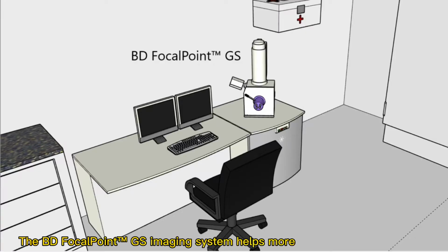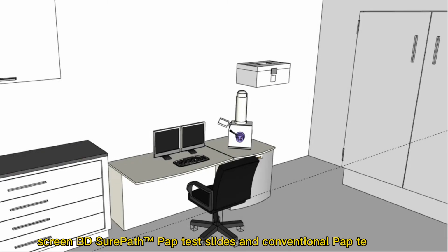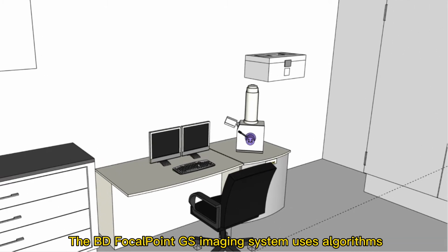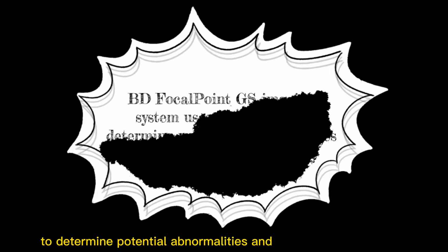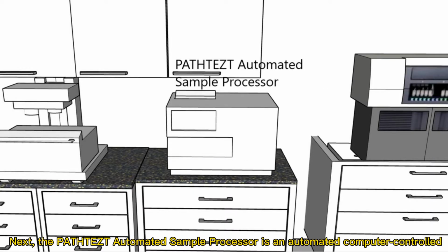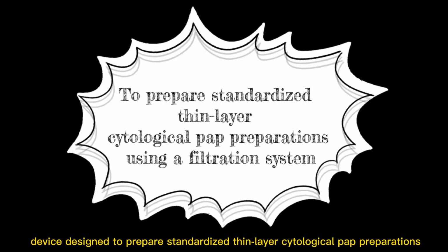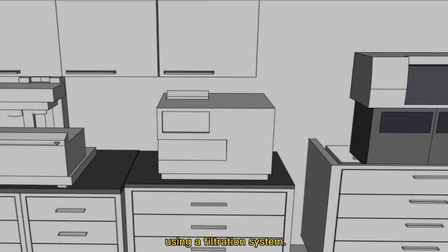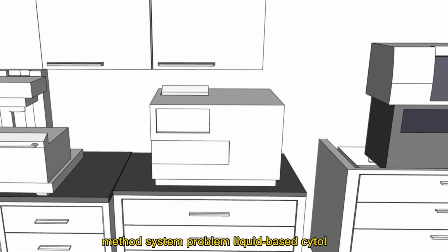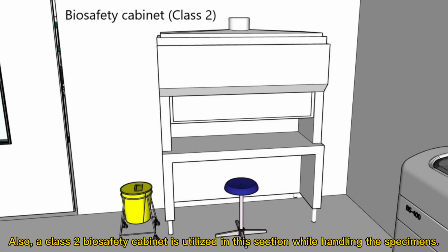The BD FocalPoint GS imaging system helps more accurately and efficiently screen BD SurePath, Pap slides, and conventional Pap slides. The BD FocalPoint GS imaging system uses algorithms to determine potential abnormalities and rank slides accordingly. Next, the automated sample processor is an automated computer-controlled device designed to prepare standardized thin-layer cytological Pap preparations using a filtration system. This system is a special improvement of the automated system for liquid-based cytology. Also, a Class 2 biosafety cabinet is utilized in the section while handling the specimen.